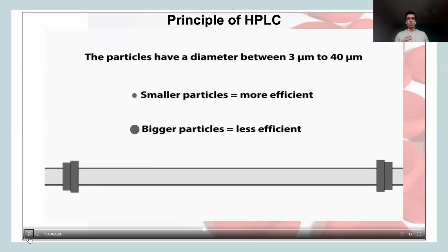For hemoglobins itself, you don't need that setup. HPLC will be sufficient because of the molecule itself and its properties, but it really depends on what the stationary phase, the column, is made of. So you can see that smaller particles compacting the column are going to be more efficient because it's going to be targeting it better. It's going to retain it better to again be eluted. Bigger particles mean that it's going to be less efficient because many more molecules will be there, and then you need to target it differently.